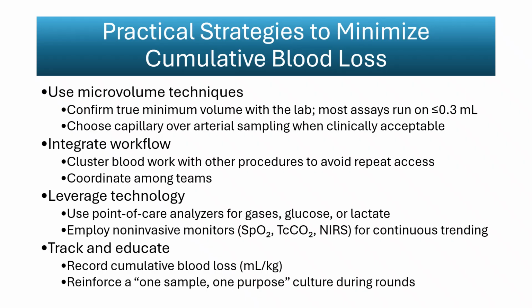When combined with non-invasive monitors such as pulse oximetry, transcutaneous carbon dioxide, or near-infrared spectroscopy, they allow continuous trend monitoring without repeated sampling. Tracking cumulative blood loss in milliliters per kilogram each week helps teams visualize the impact of testing. Reinforcing a one-sample, one-purpose approach during rounds promotes a culture of conservation and helps maintain hematologic stability in extremely preterm infants.